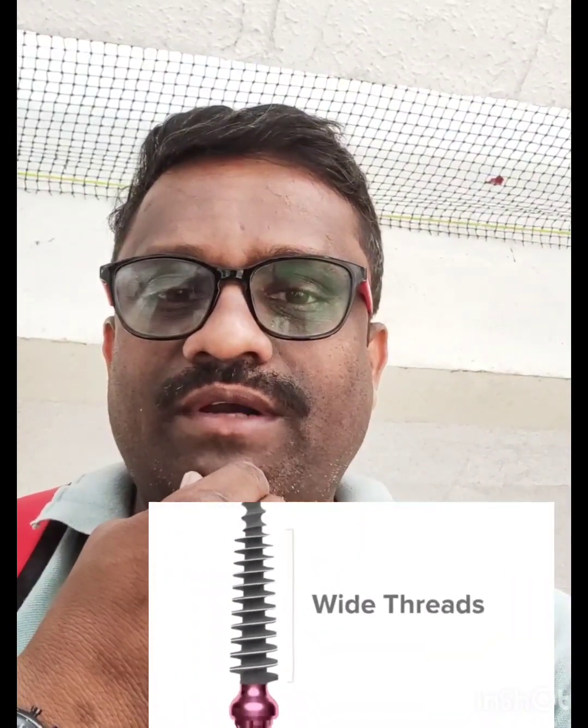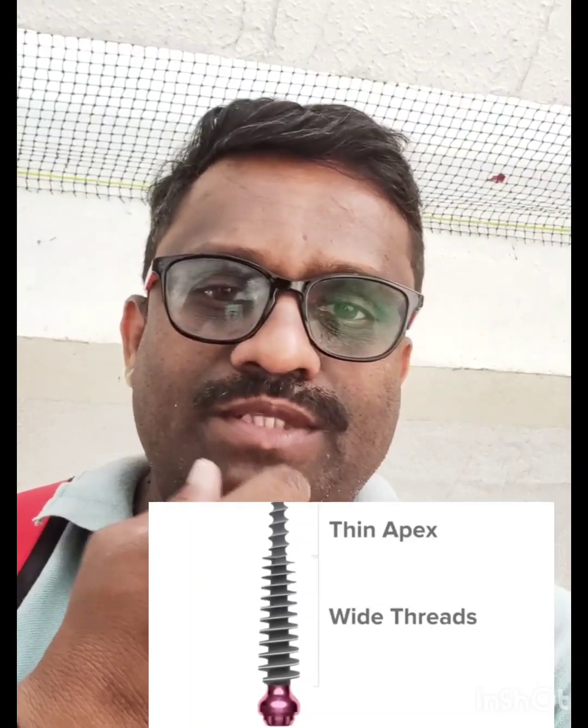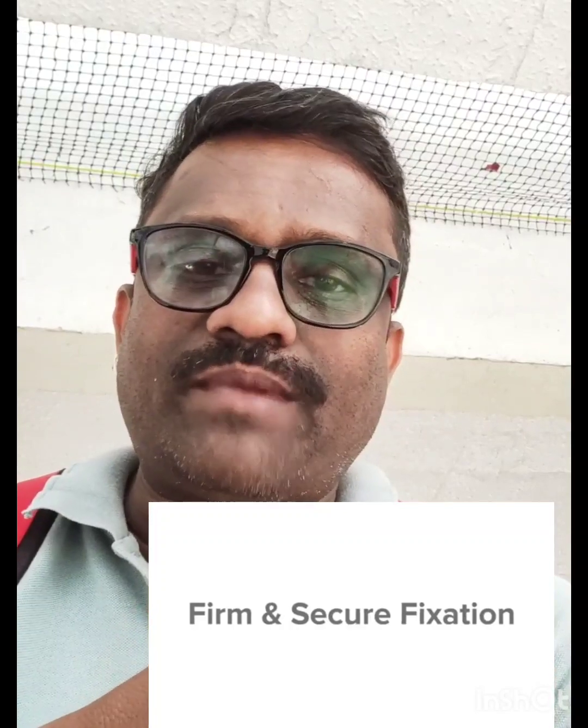Placement of the pterygoid implants. So these pterygoid implants, usually we place them in small cases to get good proper anchorage from the posterior maxilla. That is, these pterygoid implants are placed from the second molar area in the maxillary arch till the area beyond the tuberosity of the maxilla.